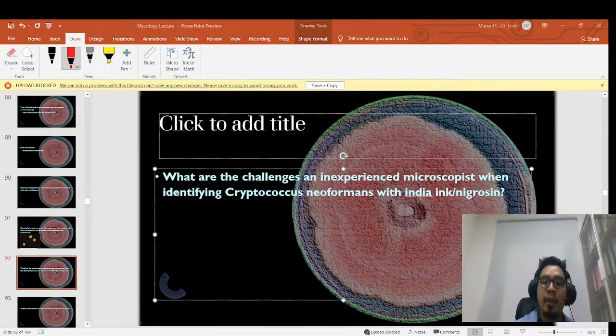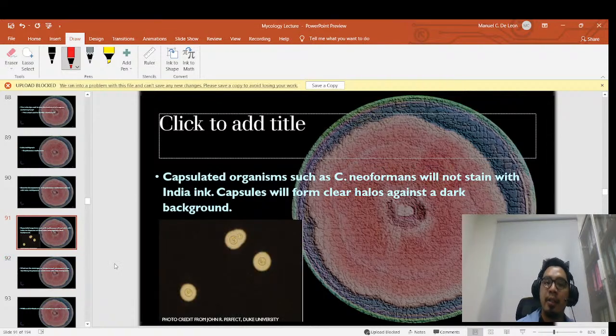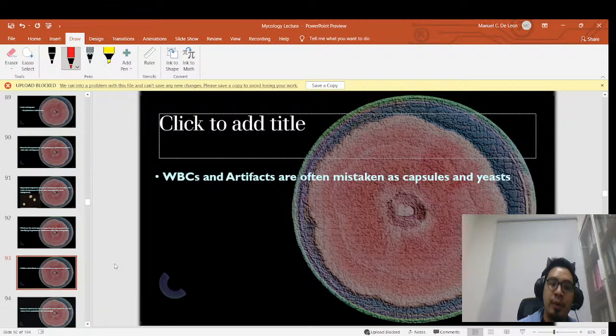You will be confused with different things. Actually, there are two things that you might be confused with, because a beginner will not be able to identify this immediately. Look at the appearance, guys. It looks like WBCs, right? So the challenge would be identifying whether or not that is Cryptococcus neoformans or an artifact. Sometimes artifacts can be a hindrance to identifying it correctly.